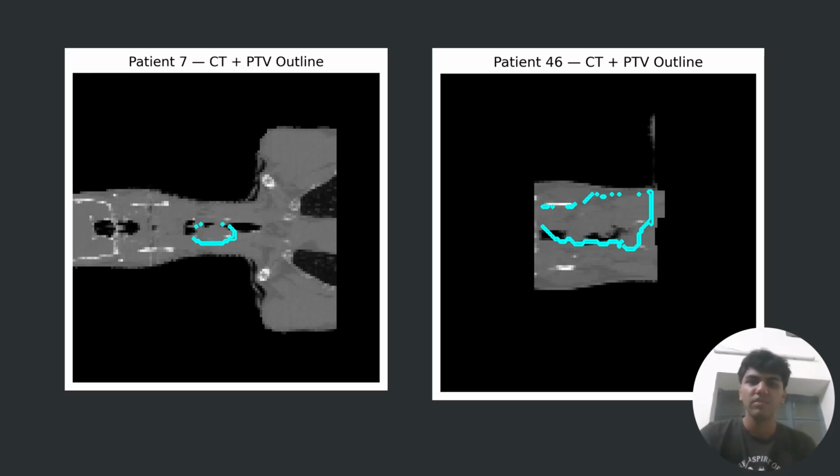In our pipeline, these anatomical masks are part of the input to the reinforcement learning agent. The agent observes the CT structure, the tumor mask, and organ at risk masks, and learns how to consistently select beam angles that maximize tumor coverage while limiting radiation to nearby structures. So, these images demonstrate both the challenge and the motivation. Patient anatomy varies widely, tumor geometry is complex, and automating the decision making can help ensure consistent, high-quality planning across diverse cases.